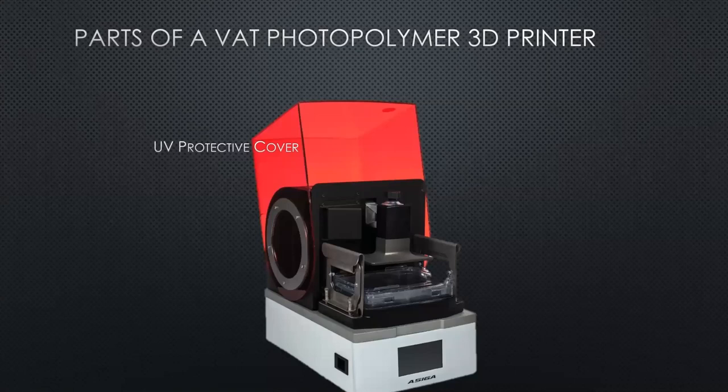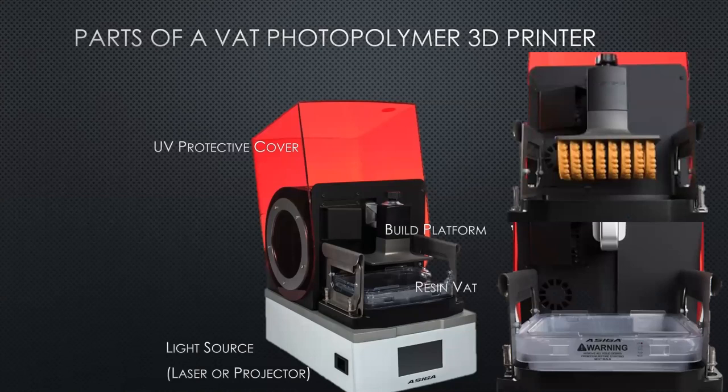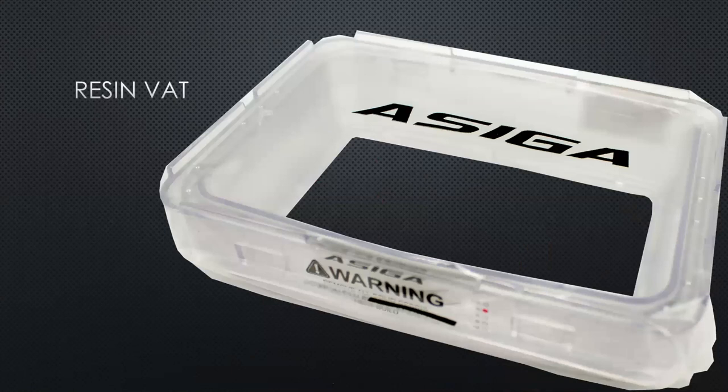The next thing you'll need is a light source or light engine. So either a laser or a projector usually. Then you have your build platform, which we had discussed previously, and this is where all your parts would adhere to. And finally, you have your resin vat. It can also be called the build tray, a resin tank, a reservoir tank, a resin tray, etc. The resin vat is a container with an optically clear bottom, and it holds a certain volume of resin so that your build platform can raise in and out of it.